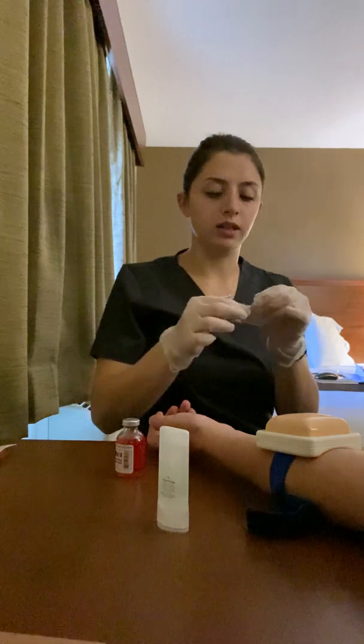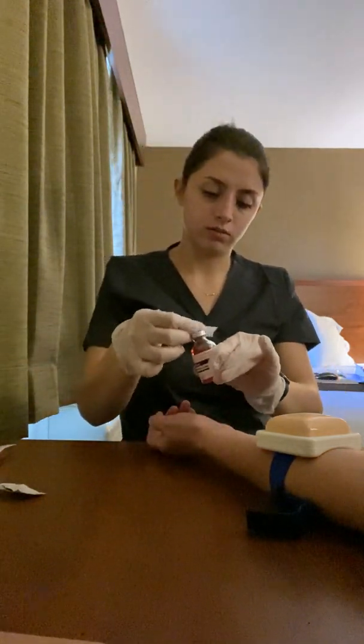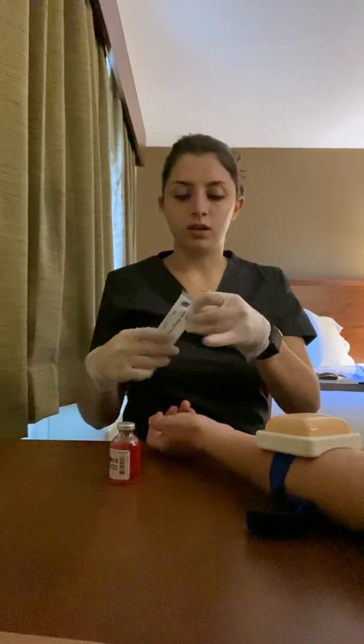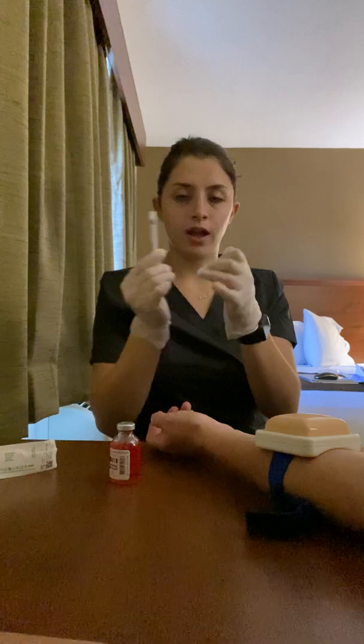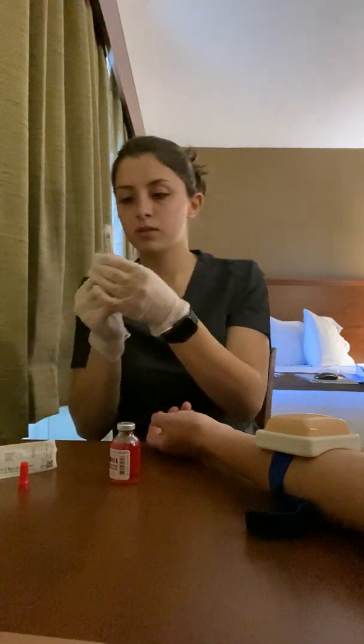First, I'm going to clean the top of the vial. I'm going to pull the amount of air that I'm going to be injecting, which is 0.1 milliliters.